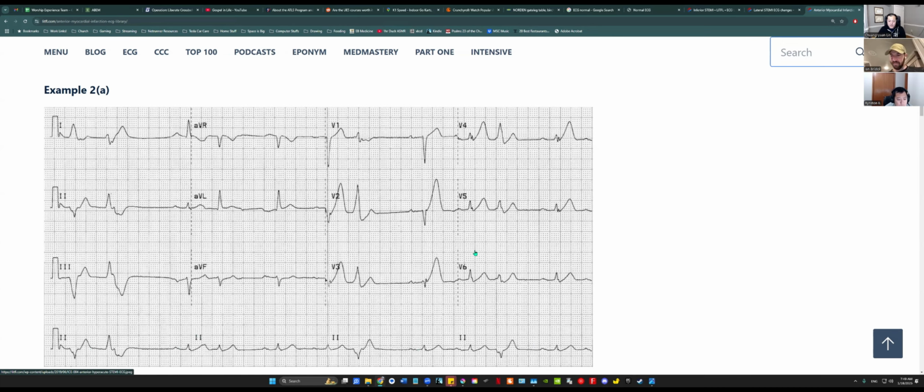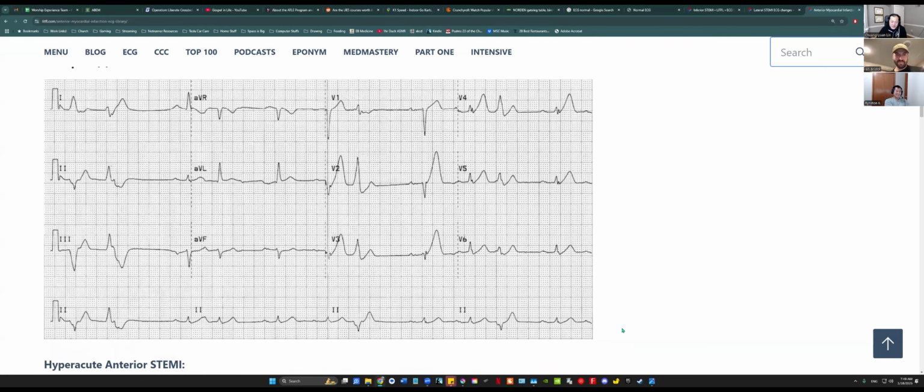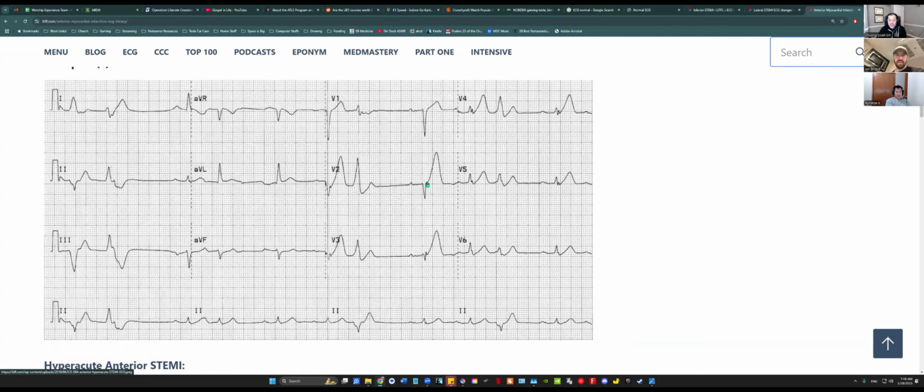All right, let's see if we're right. Hyperacute anterior STEMI. Yay! Nice. Okay, cool. This one's tricky.